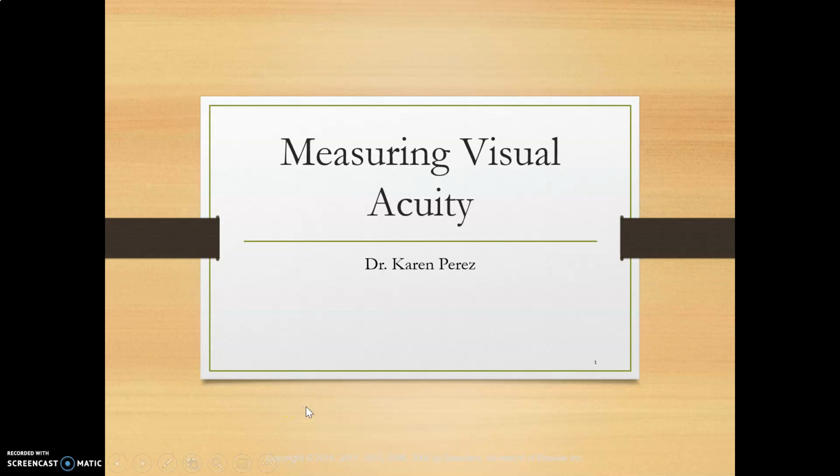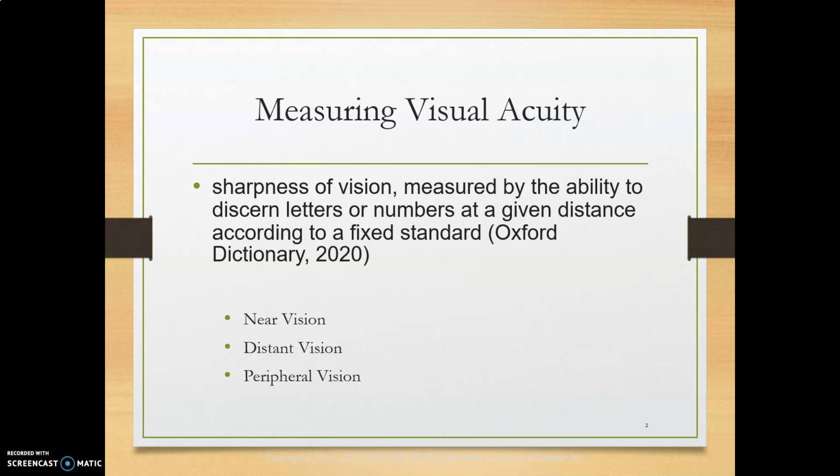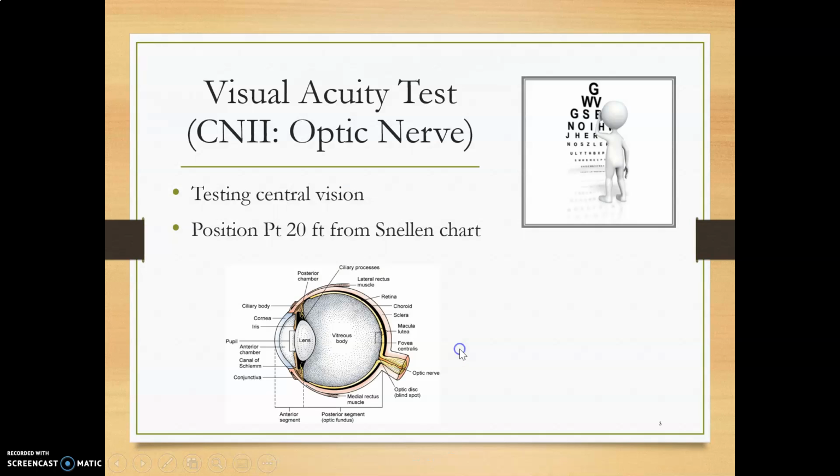So, what is one measuring when measuring visual acuity? What we're actually looking at is the sharpness of the vision. This is measured by the ability to discern letters or numbers at a given distance according to the standard, and in this case, it is 20 feet. So we'll be looking at near vision, distant vision, and peripheral vision.